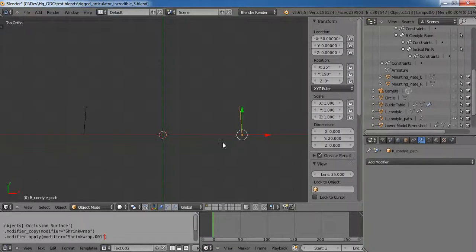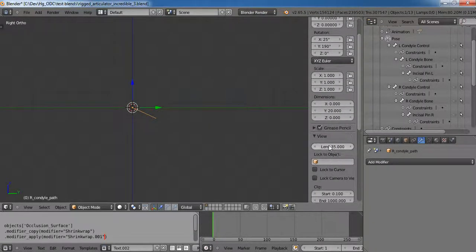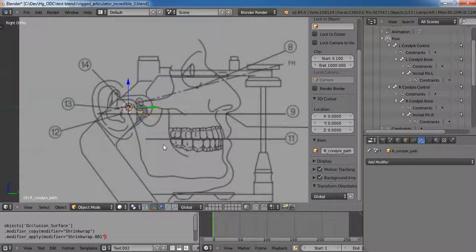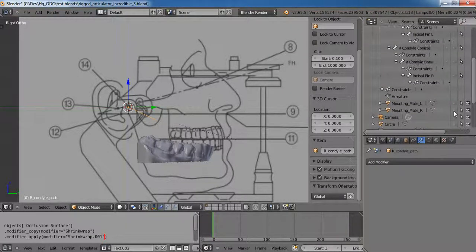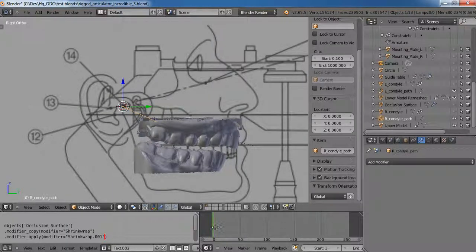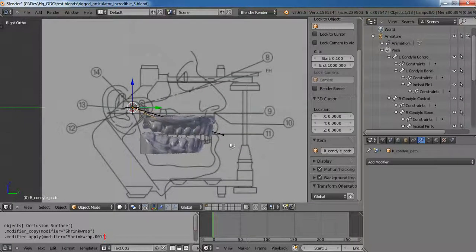Okay, so now let's build a little bit more of our articulator. Images. Okay, so here we have our images. Let's say we took a face bow and we're able to mount our upper and lower models. Okay, good, everything's working. We can take a peek at all these other bones back here, and granted this doesn't come out all the way here to an incisal table like it should, but the principle is still there.